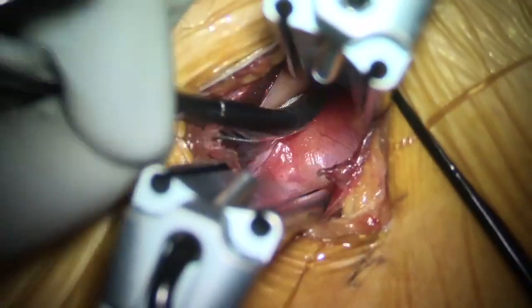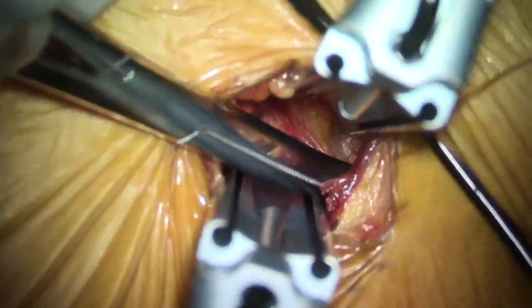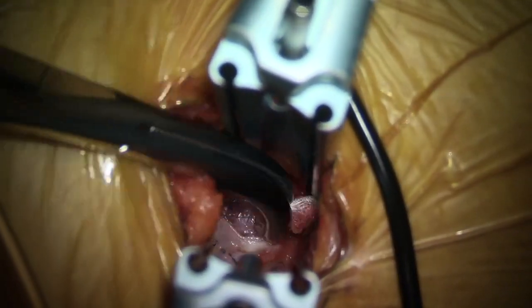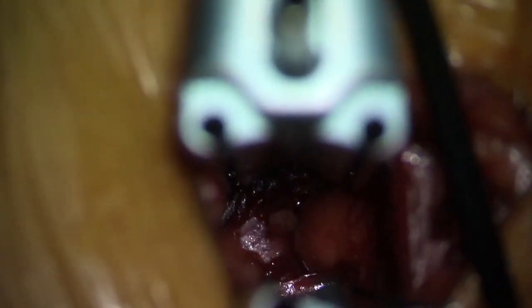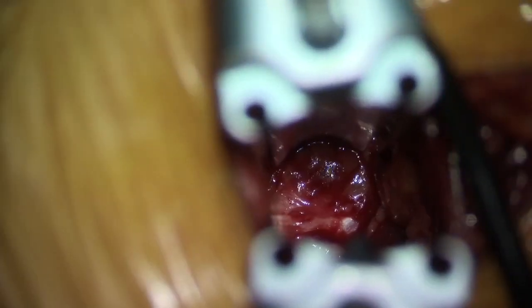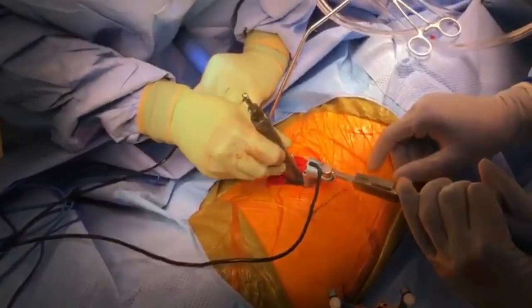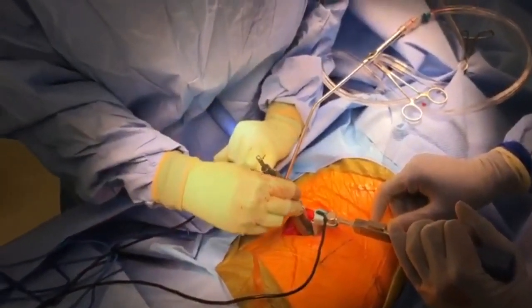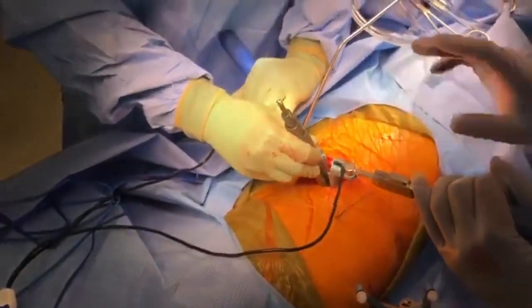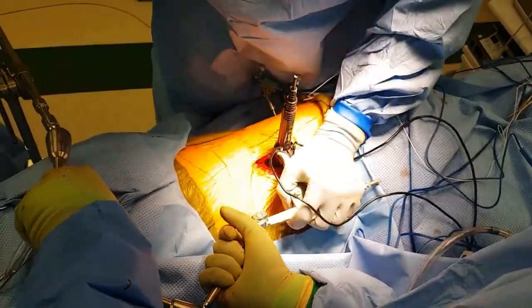The first muscle is the external, then internal, then the third layer, and you place your retractor system there. Once you identify the disc space with the help of your finger, you can see the retroperitoneal fat — just do blunt dissection and move everything anteriorly. Everything will fall in front of the psoas. Once you palpate the disc space, place a marker.